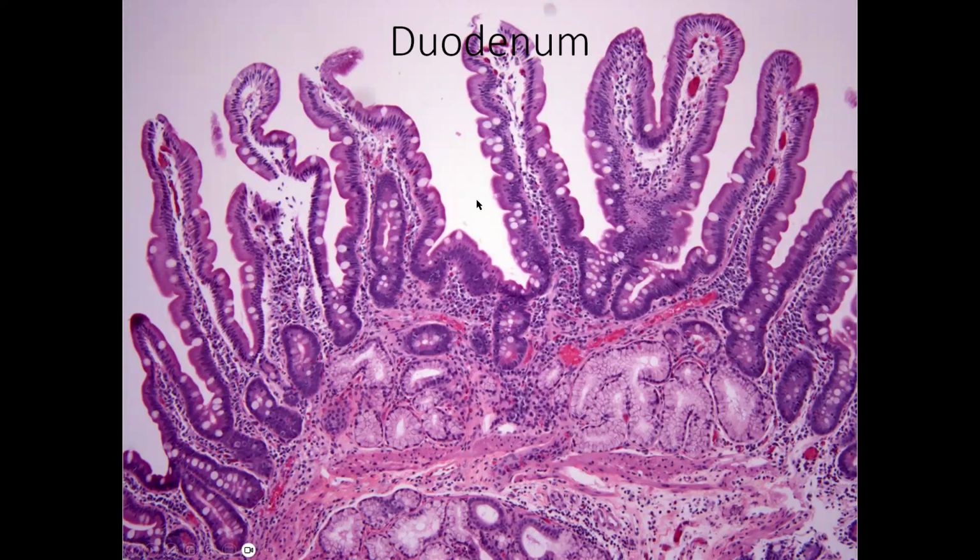Moving on to the duodenum, here's normal duodenum. So, I'm sure you realize that there are villi in the duodenum. And so we see these nice long villi. They're about maybe 5 times longer than the glands in normal duodenum. There's also these mucin-producing Brunner's glands here.